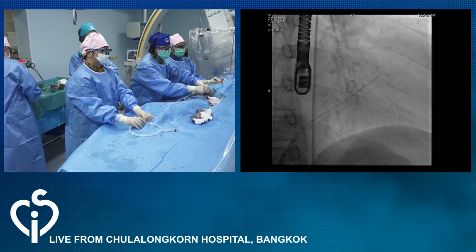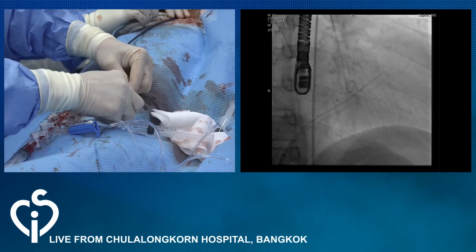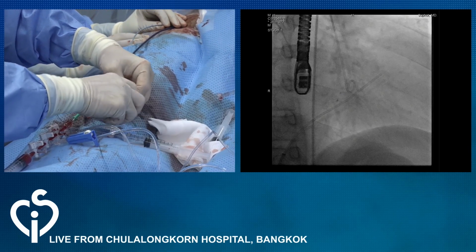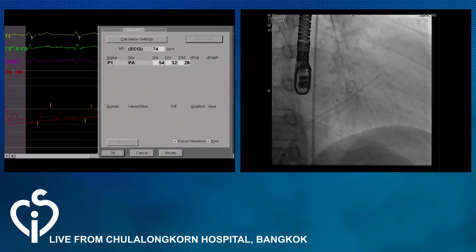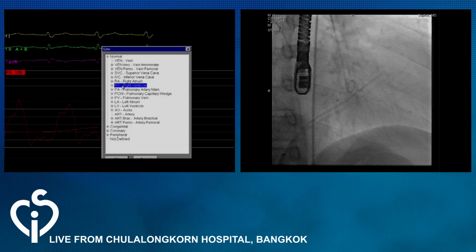If you get to the EKG, the EKG showed right bundle branch block, but do you see the P wave in the EKG? Please show again. We'll check with them. Is this the P wave or is it not sinus? Yeah, this is the P wave.